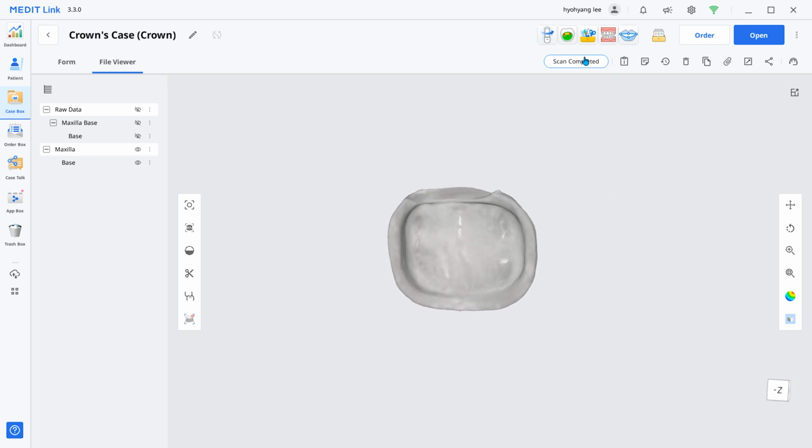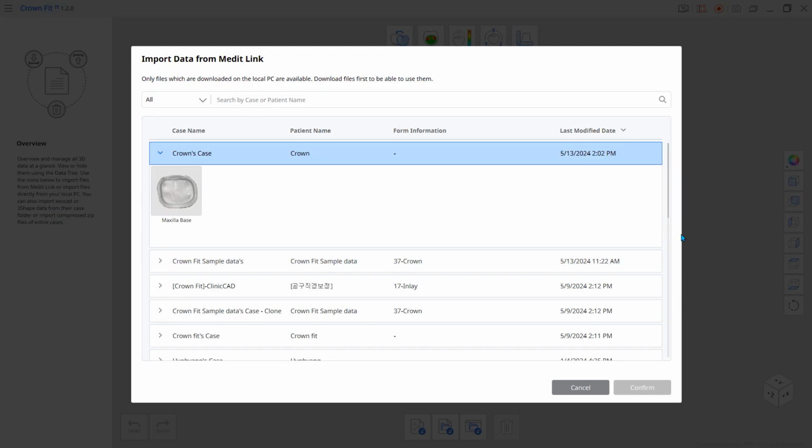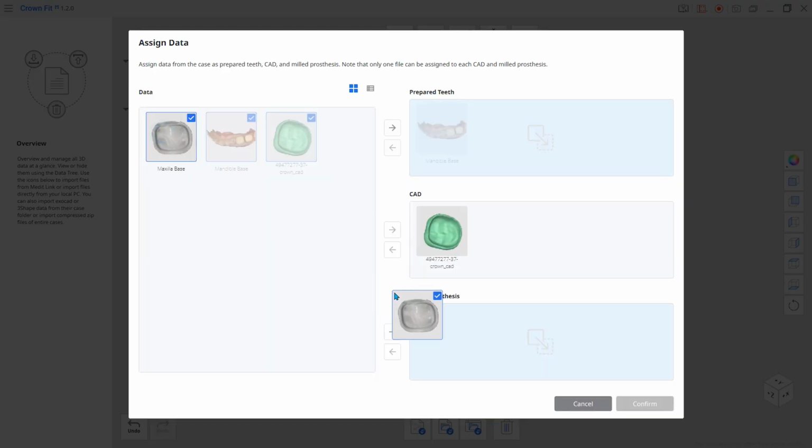Now, run the Medit Crown Fit app. Select 3D data files to import from Medit link. You can freely choose files from different cases. Select the milled prosthesis scan data just acquired, the prepared teeth data, and the CAD data. Assign the appropriate data for each category.